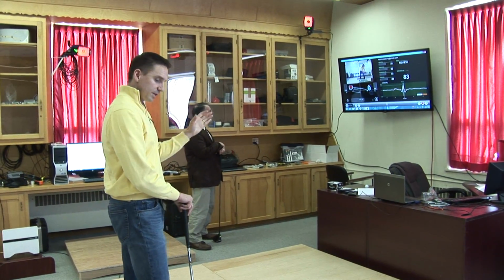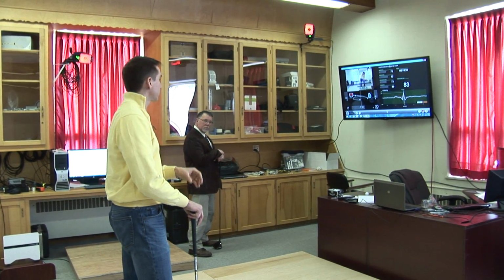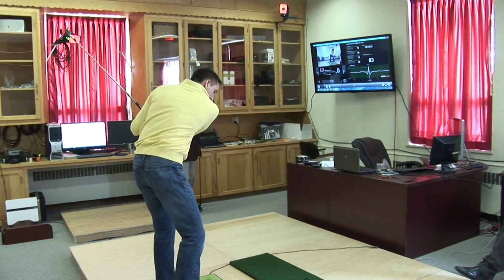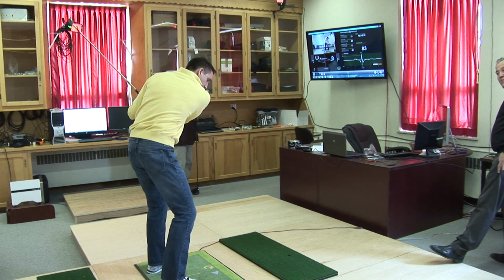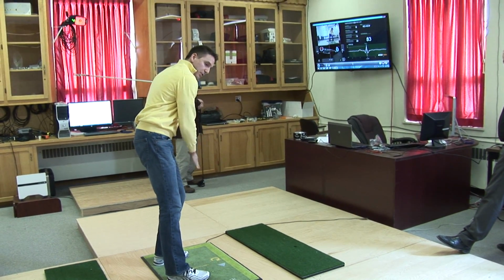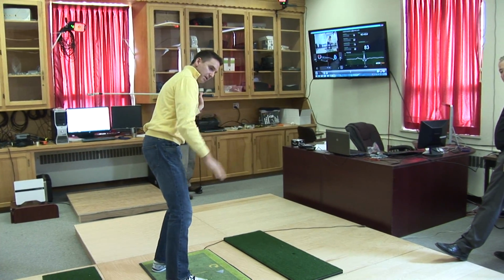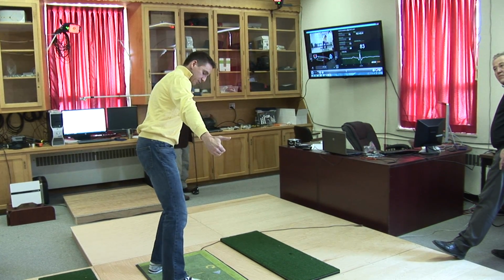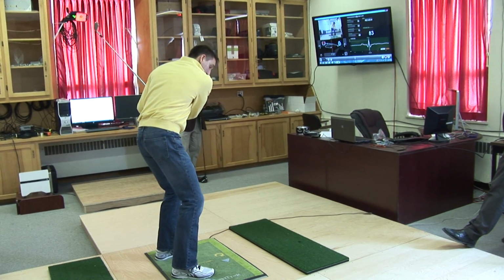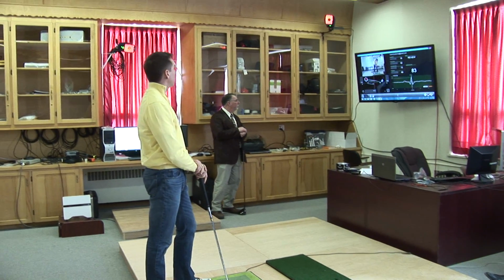Well, remember, the center of pressure trace is showing the average location of the vertical force application. So for my swing, in order to get into a position where I'm continuing to move my center of mass towards my lead side, I am actually, at that point in the swing, pushing harder off my trail foot downwards than I am off my lead foot. So hence, the center of pressure trace is going to move back, indicating that I'm pushing down firmer with this one. But that is in an effort to get over to my lead side. So that's why you see it shoot all the way back from my front foot.